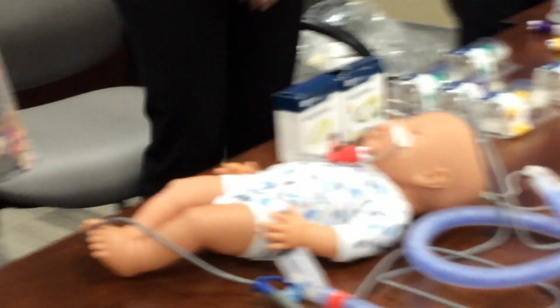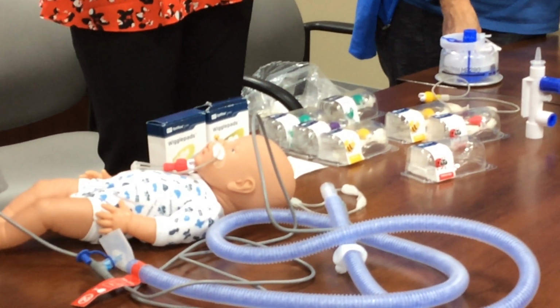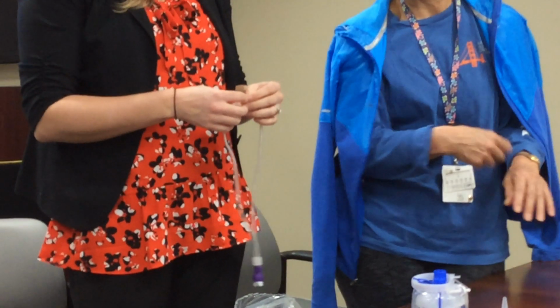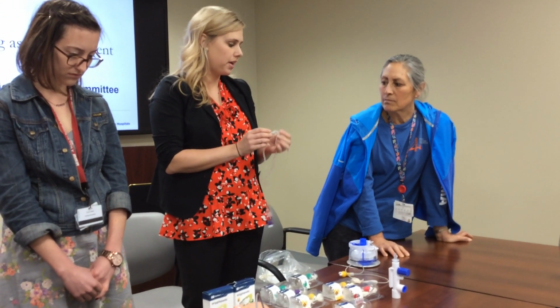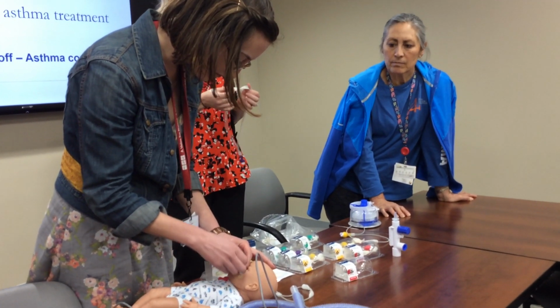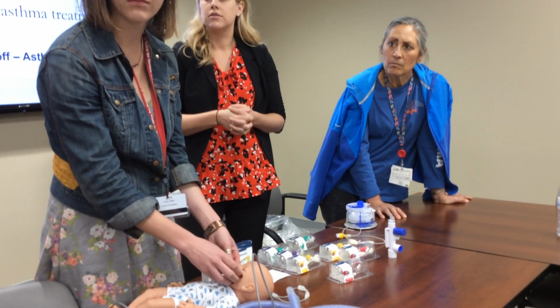If we notice their patients are desatting on there, what should we check first? See if the prongs are in the nose. Should we be suctioning the prongs? Check to make sure they're not occluded, or just check the flow? Yeah, you can. Sometimes if they pop out, they can be bent over to the side. It's a very soft silicone prong, not like your traditional hard plastic cannula. So make sure they're in the nares properly. You can pass a suction down there too. So we should suction one nose at a time, then tape it down, and then do the other one? Okay.